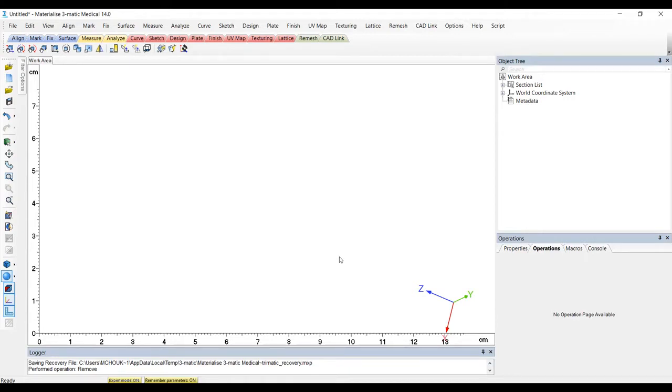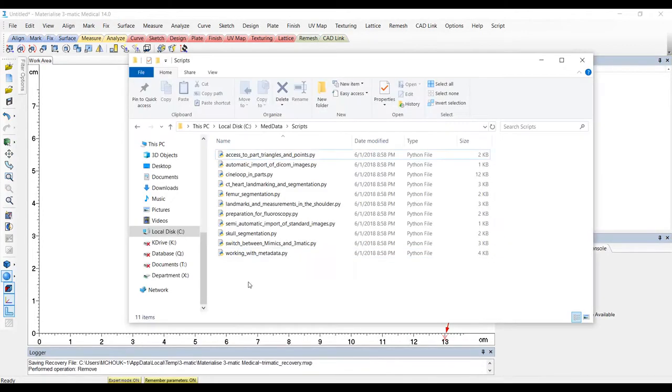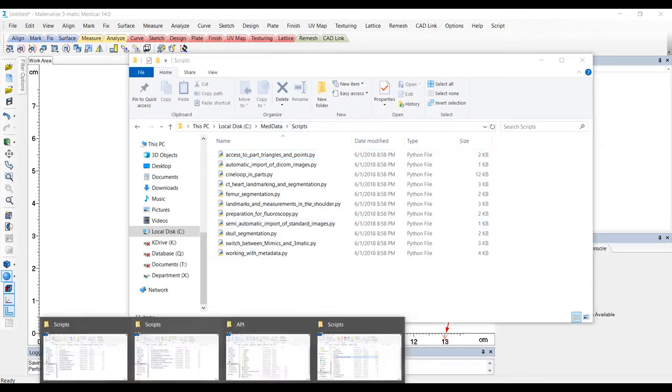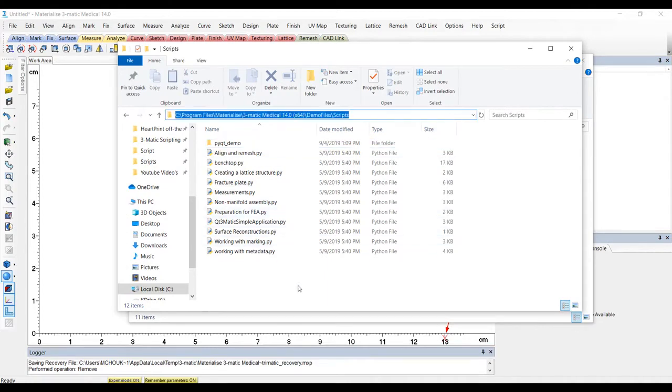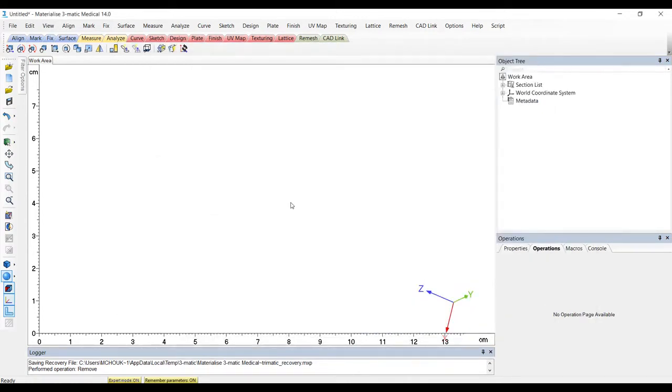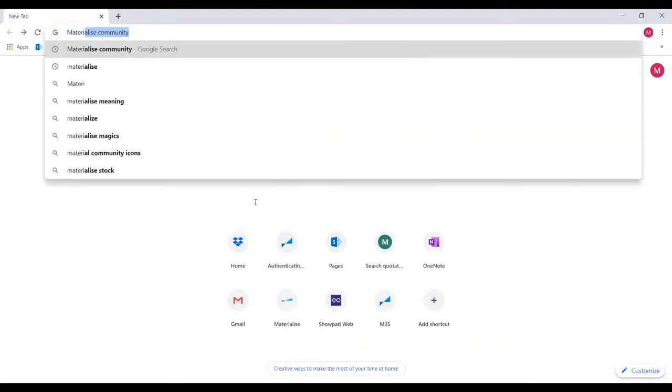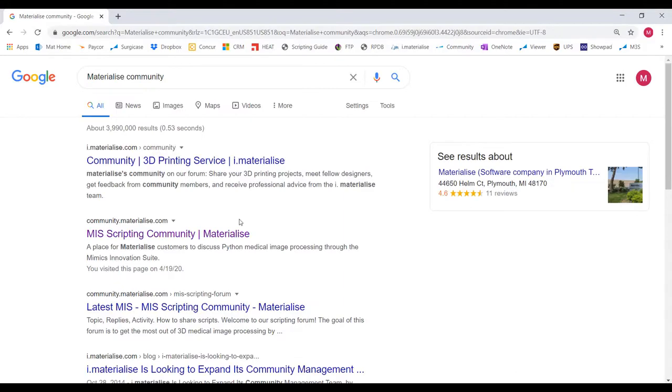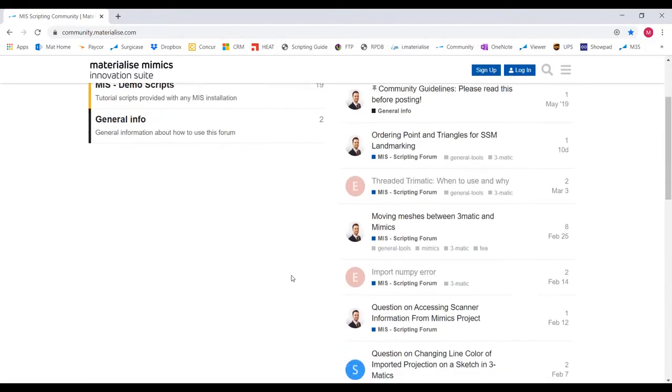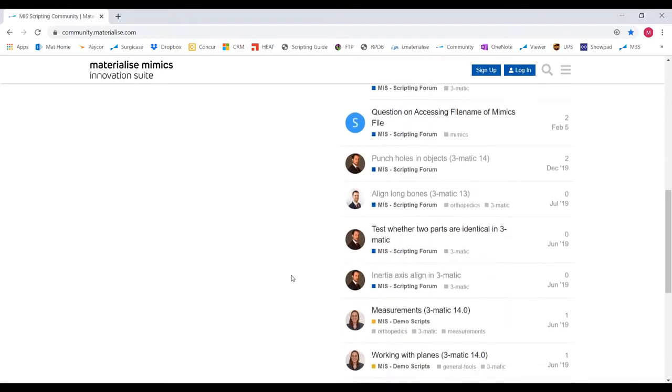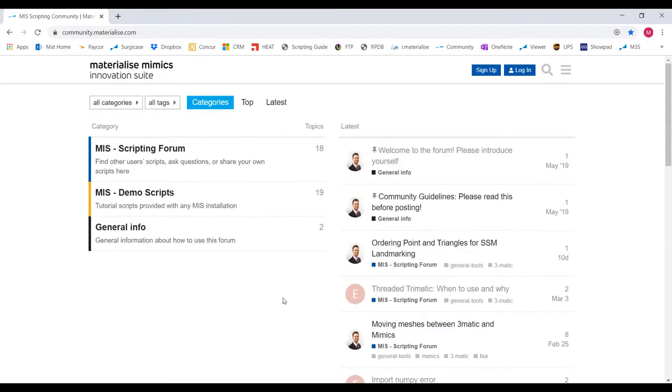When you install Mimics, the software comes with multiple scripts we've written for you that we find to be pretty common workflows. You can find Mimics existing scripts here and 3Matic existing scripts here. Another place you can find existing scripts is on our materialized scripting community website. Here you will find our expert scripters post some interesting scripts that might be exactly what you're looking for or have pieces that you need for your workflow. This is also where you can ask questions to our experts or upload your script that you'd like to share with us or the rest of the scripting community.